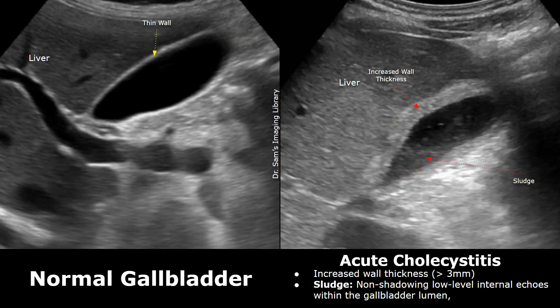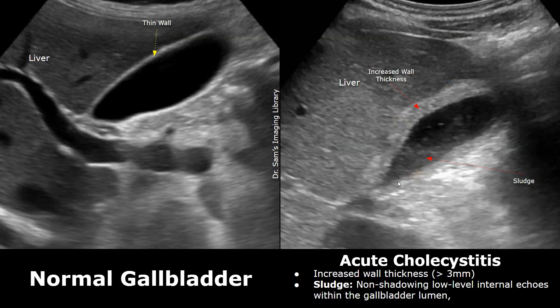Gallbladder sludge is thickened bile that gets built up. It often occurs if the bile stays in the gallbladder for too long. Sludge appears as non-shadowing, low-level internal echoes within the gallbladder lumen. Sludge does not cause posterior acoustic shadowing. It often lies down on the gravity-dependent posterior wall of the gallbladder. It may also cause acute cholecystitis. The gallbladder wall is abnormally thick, measuring greater than 3 mm.